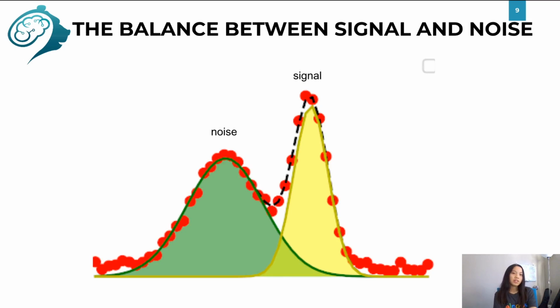And as you already know, EEG data contains signal and noise. So appropriate pre-processing will attenuate the noise in the data. However, signal and noise are often mixed together and may be difficult to disentangle completely. Thus, there is a trade-off between signal and noise. Removing a lot of the noise would likely remove some signal, and leaving as much signal in the data as possible would likely keep the noise. So your criterion for balancing signal and noise may influence the steps of your pre-processing.